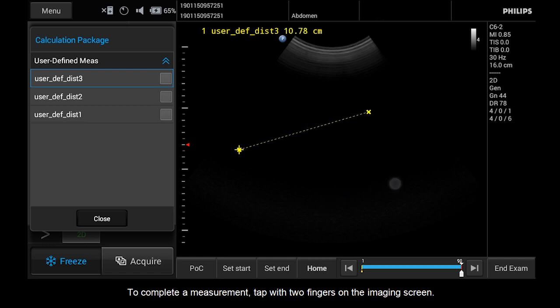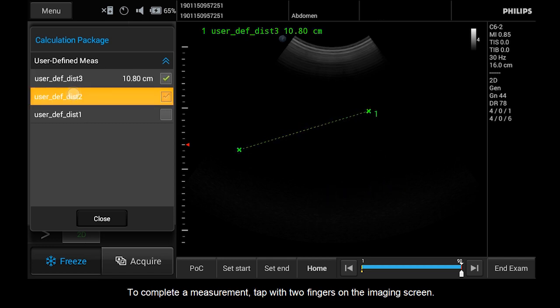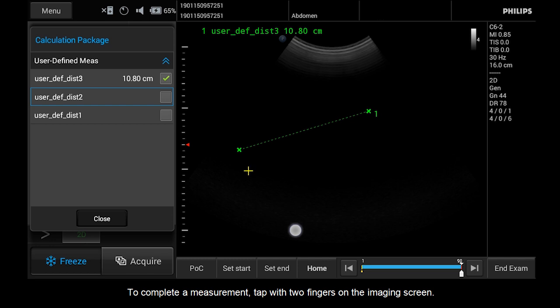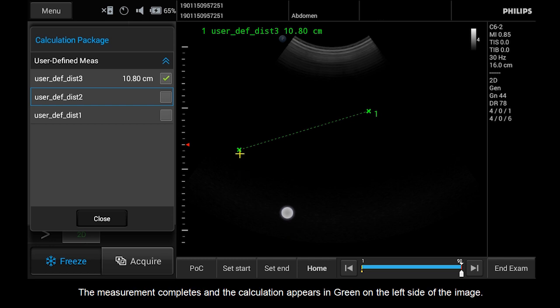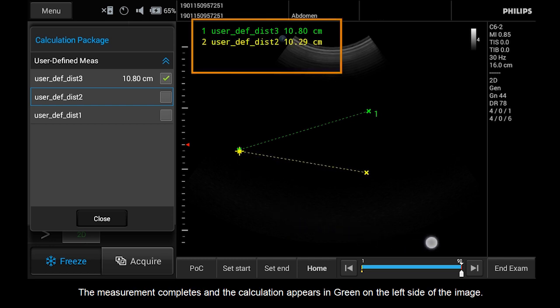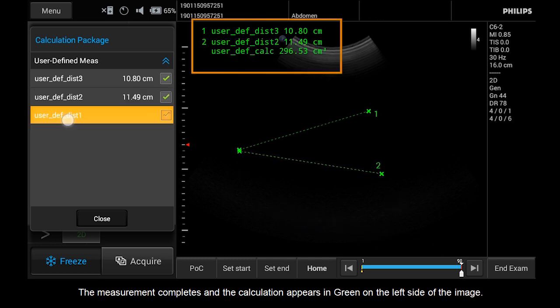To complete a measurement, tap with two fingers on the imaging screen. The measurement completes and the calculation appears in green on the left side of the image.